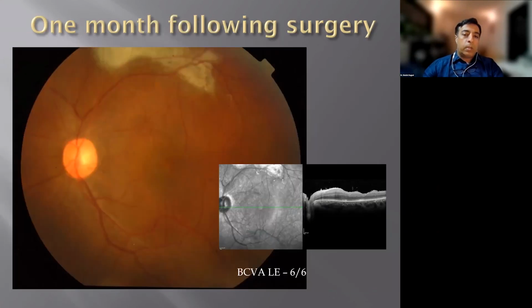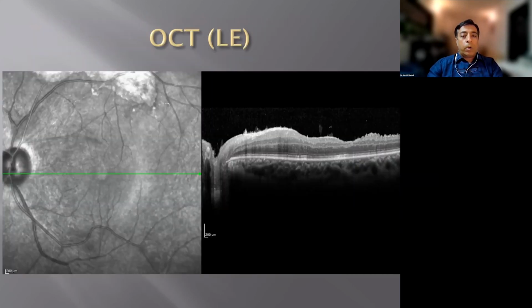And this you can see is the post-op picture of the case, flattened very well. Patient, in fact, got back 6/6 vision in this situation. In fact, had some recurrence of inflammation in the vitreous, which cleared off with some steroids, and patient retained 6/6 vision in this case. So here we didn't expect such a recovery because of the thickness and the contraction which was apparent on the fovea, but the patient did recover quite well over a period of time.